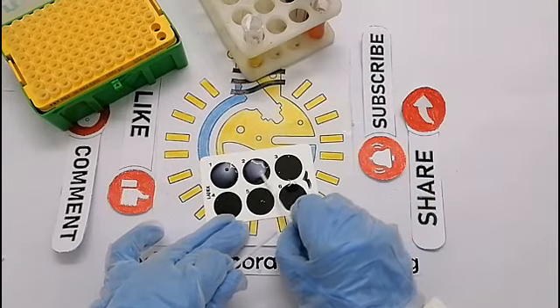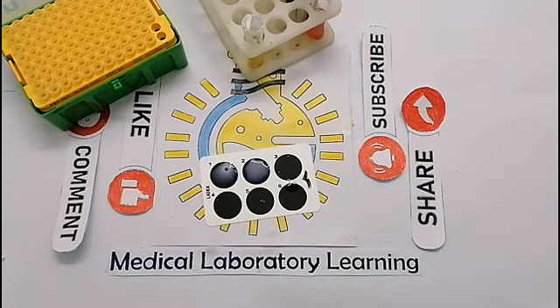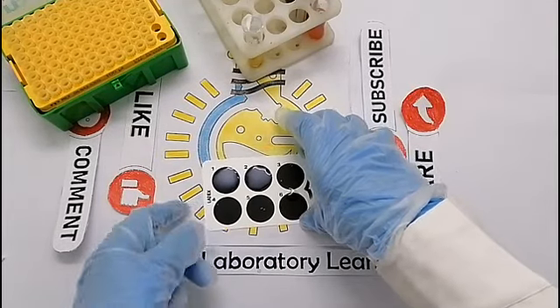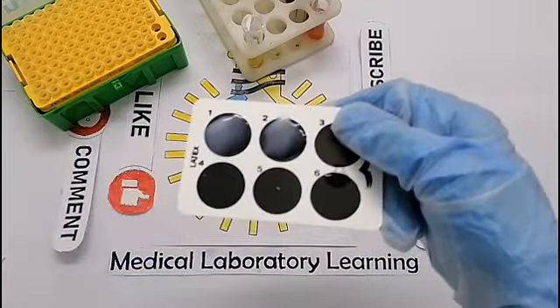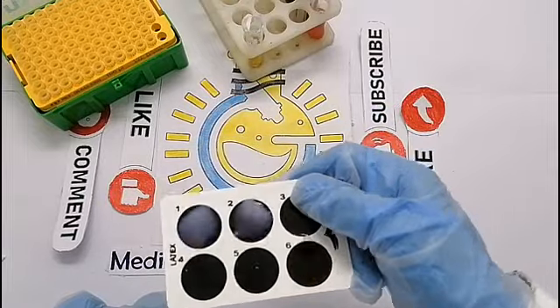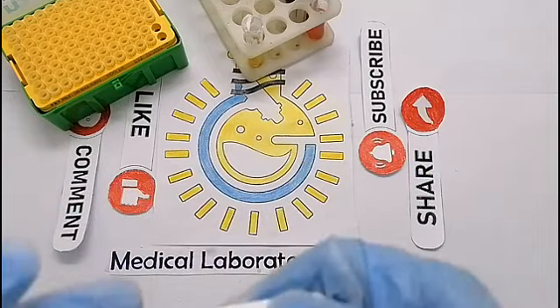After mixing the solutions, we place the slide on a shaker for 1 minute. Then we examine the agglutination under the light.